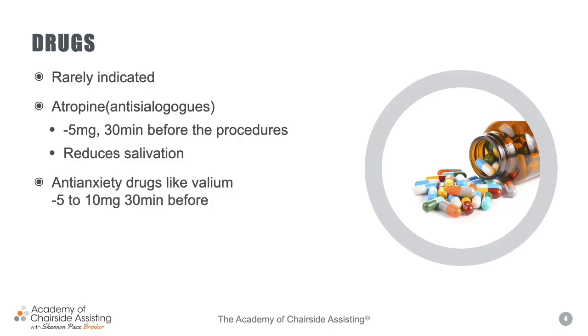A lot of times this is for those patients who are going to be sitting in the chair anywhere from 4 hours to 6 hours. It just helps not only lower the anxiety, but most importantly, dries up those saliva glands.